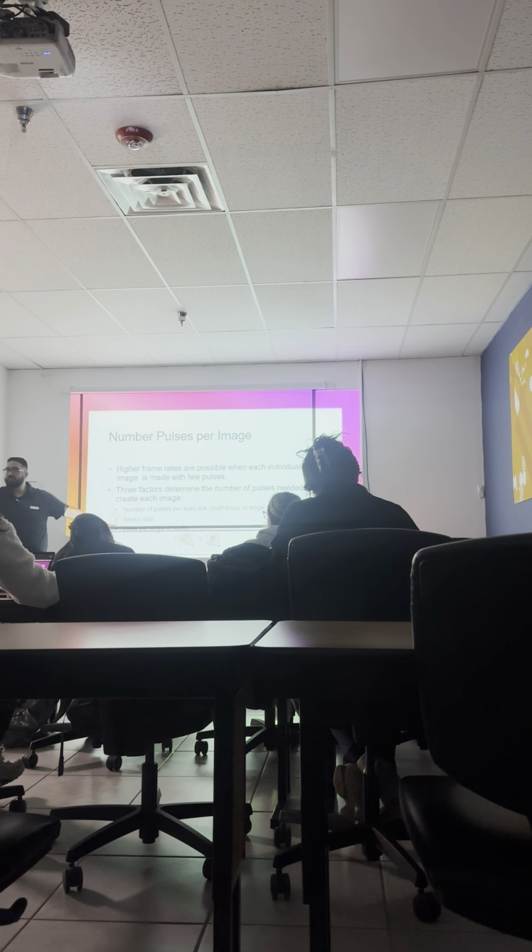Okay. Does that make sense? Would you explain the lines again? B would be better for the liver because of how many scan lines are in there. Exactly, because of how many scans there are. So in between these lines, there's missing information. Okay, so that translates to a blurry image.